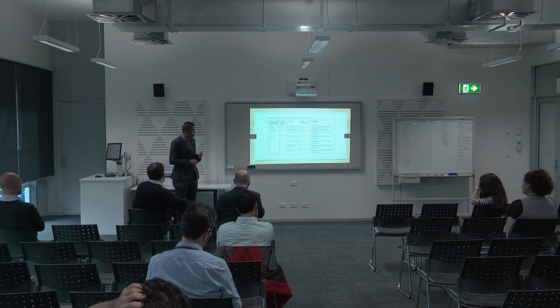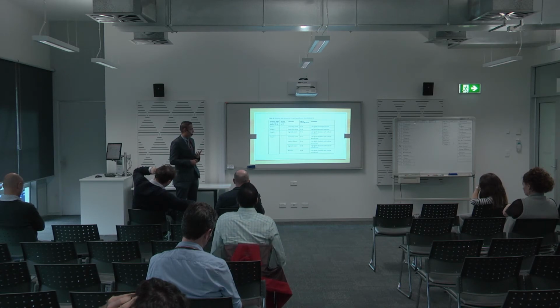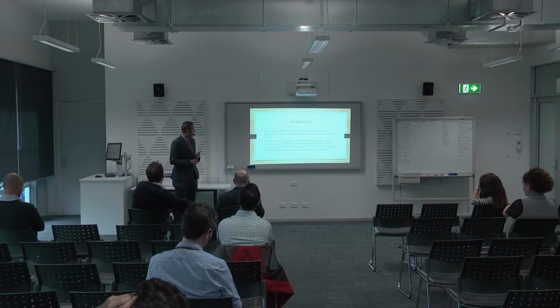And this is the histology, and essentially in the first 3 patients, we could manage them endoscopically. The 4th patient had 2 lesions which could not be managed endoscopically, so ended up in surgery. So these 3 patients are still going with surveillance and are doing quite well.